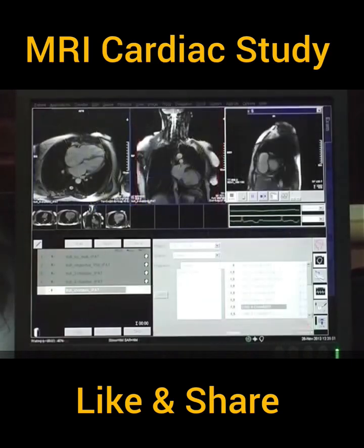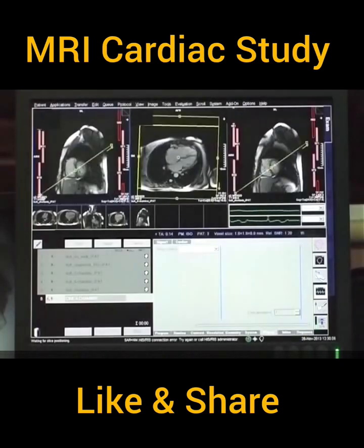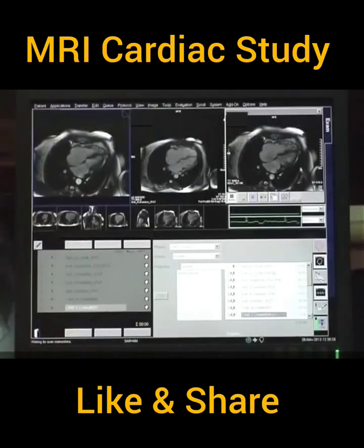To obtain approximate short axis views, on the midline short axis view, a line is drawn from the RV apex to the anterolateral papillary muscle of the mitral valve to obtain a true four-chamber view. It is called the true four-chamber view because the axis is along the true four-chamber axis of the heart.